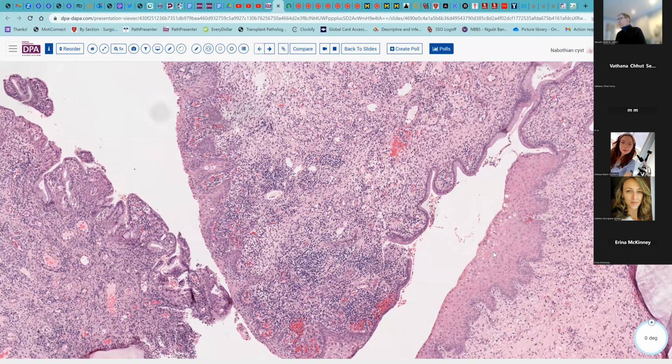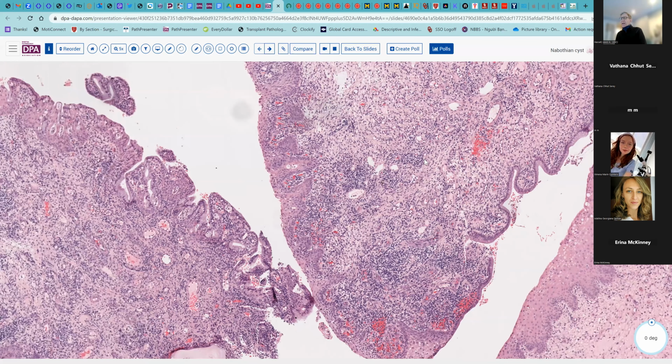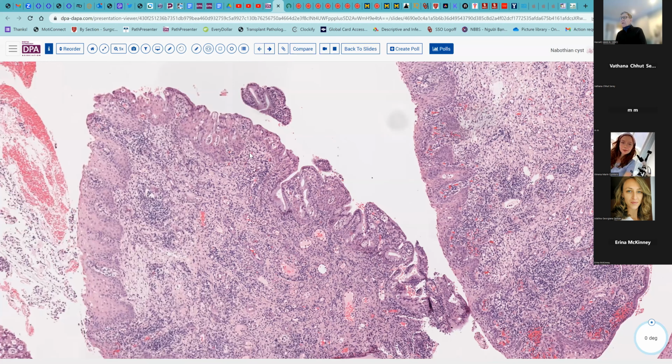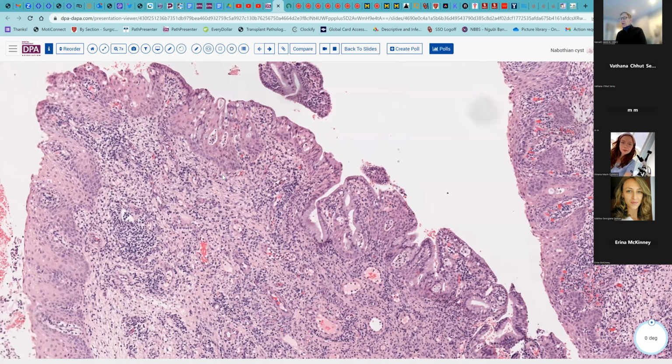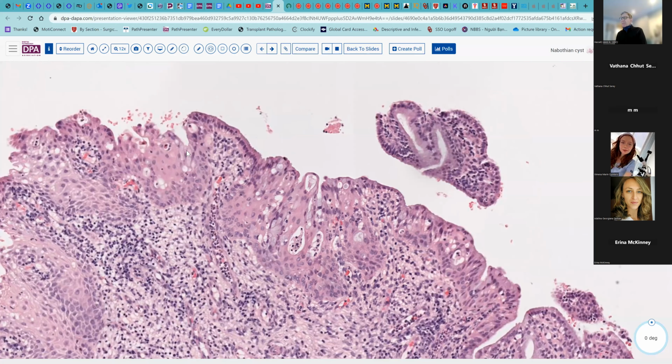So here on the right, this is more mature squamous metaplasia. Over here, we might think of this as slightly immature. And then here, even more immature would be a situation where we still have some measure of surface mucinous epithelium or glandular epithelial lining.